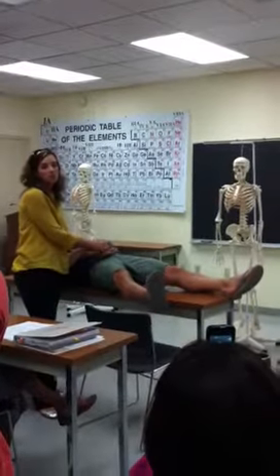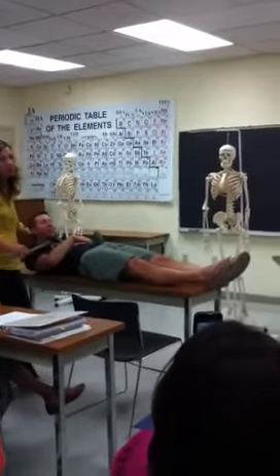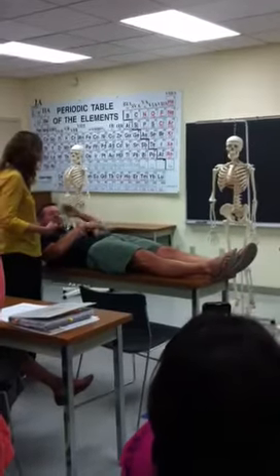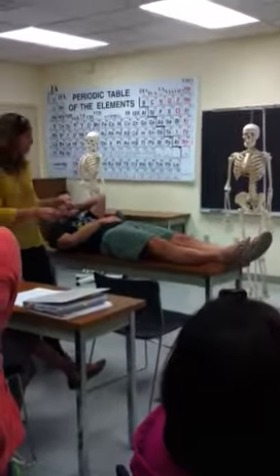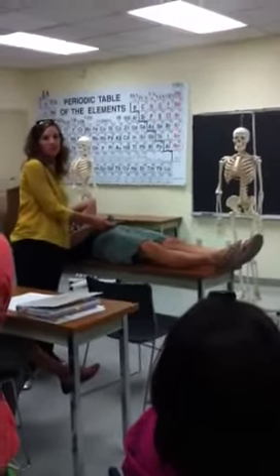And the patient — obviously when you do this in the clinic, you've got to have the patient comfortable. You want to make sure the patient is comfortable. So that's going to measure hip abduction, right?